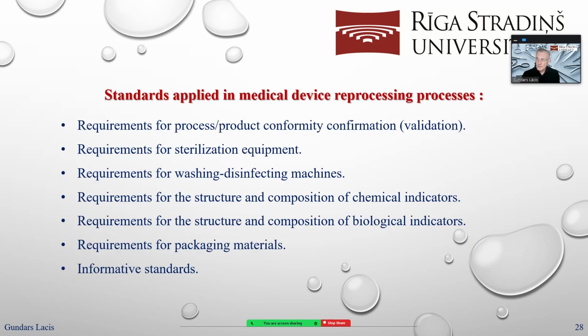For medical device reprocessing, we have 7 groups of different standards, or I would say approximately 62 different standards.